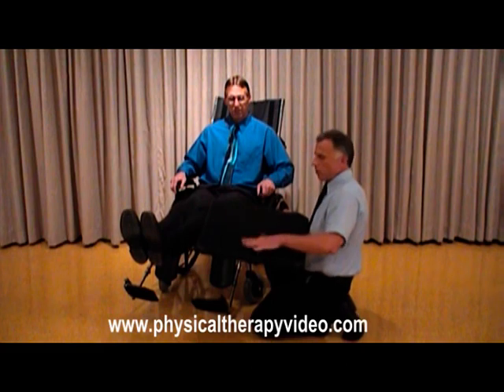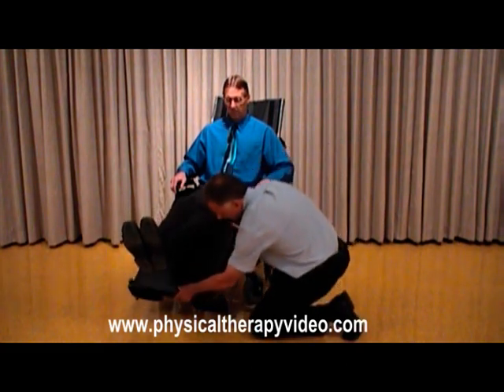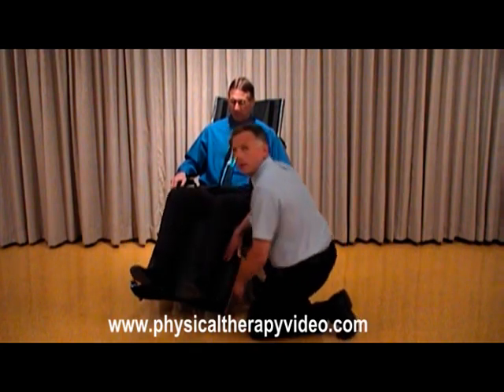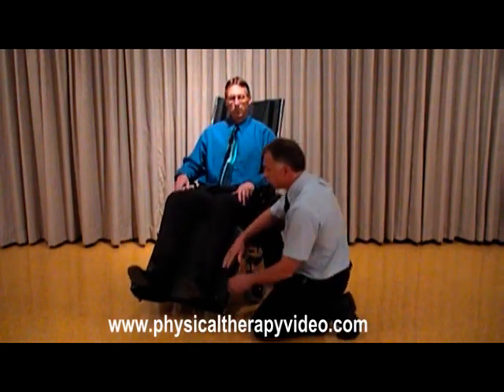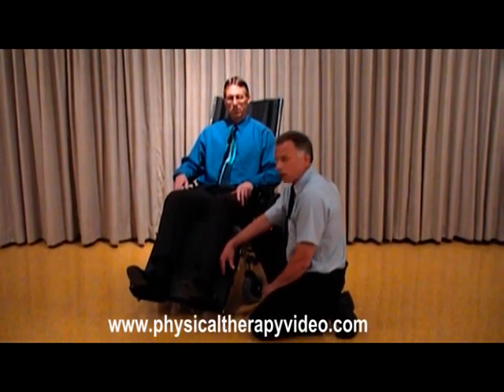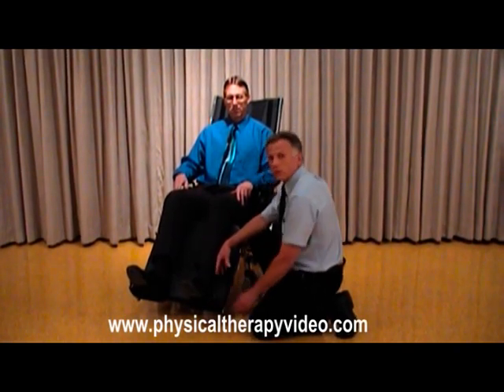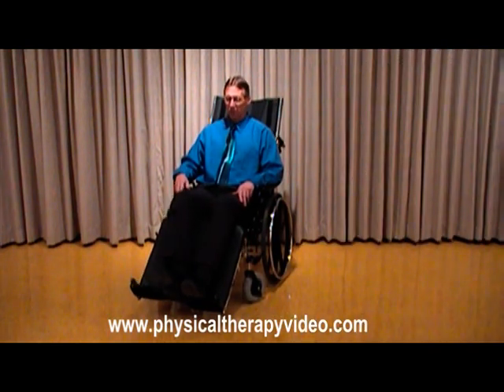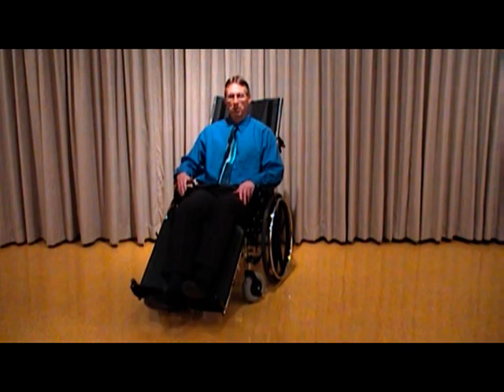And it's just a simple board that's padded. There's different designs. This one actually the maintenance department made for this particular person. It works out very well, but you can buy them from any supply catalog as well. One supplier calls them foot buddies, but it works just like that. It's very comfortable. Now I don't need to worry about my leg falling down in between, no matter what position, it's comfortable.